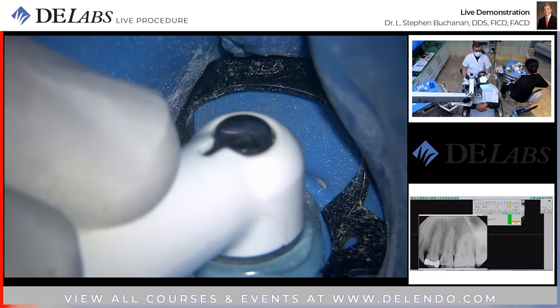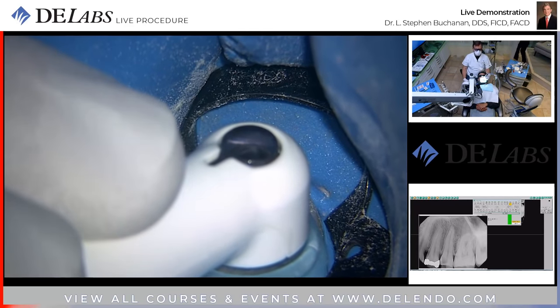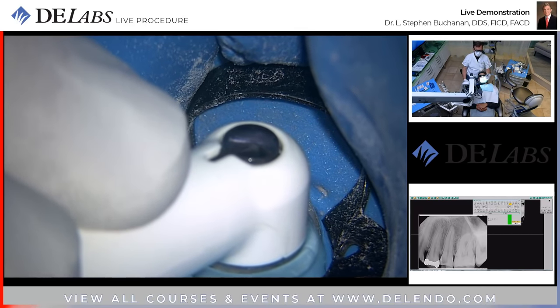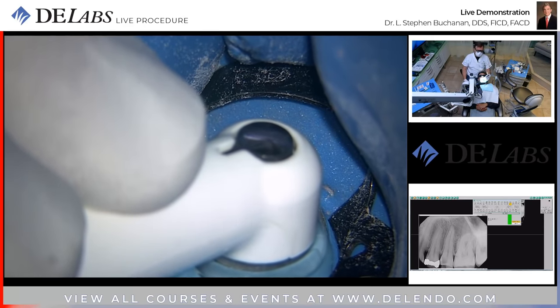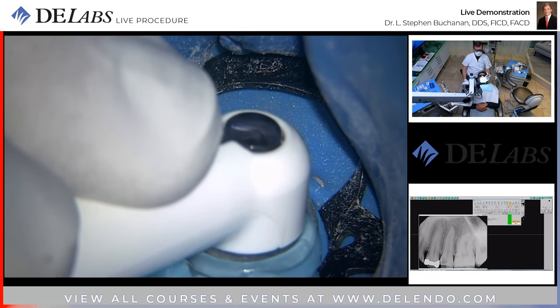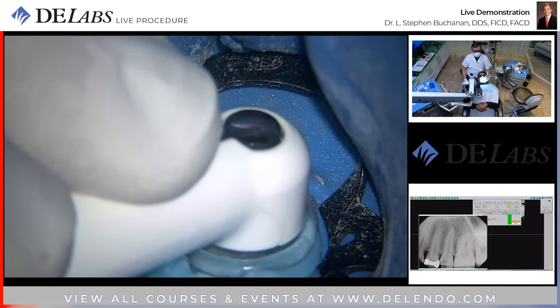Right. So Maria's going to get the hypertonic saline that is in the refrigerator. We use chilled hypertonic saline after the GentleWave procedure. Because of the negative pressure environment, it's essentially the same as putting a soda straw sealed to this tooth and sucking on it as hard as you can for 10 minutes. It's going to open up the capillary beds in there.